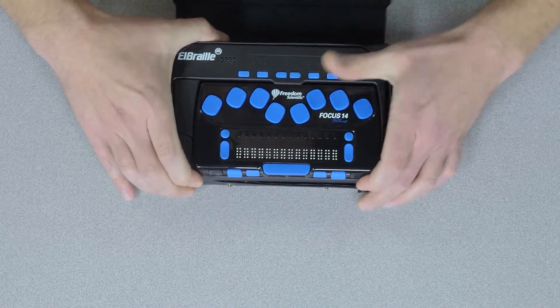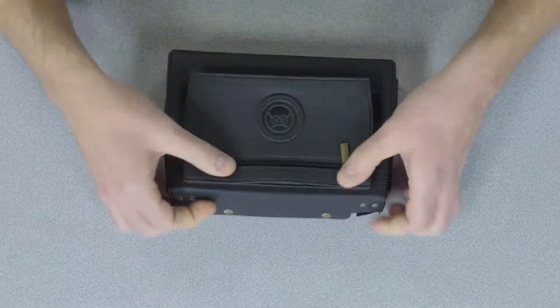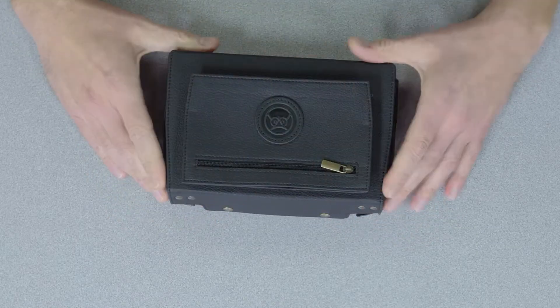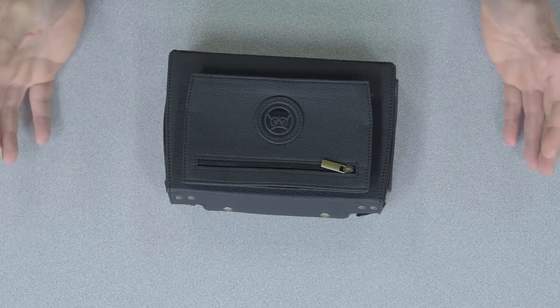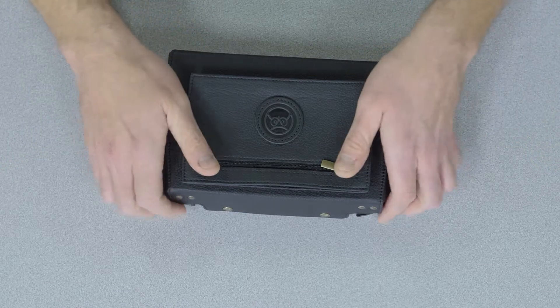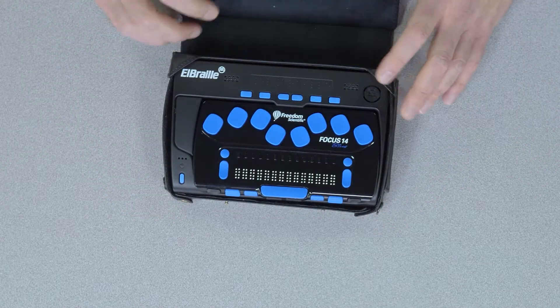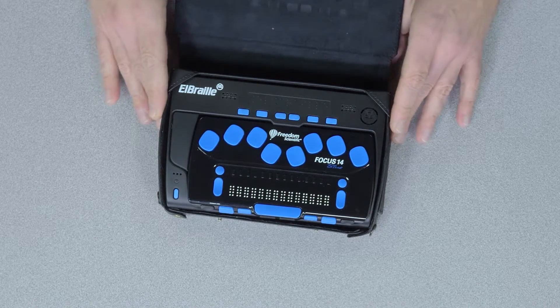It fits really nicely in this carrying case and snaps down just like that — you can carry any extra materials with you just like that. Essentially now a Braille user has a portable computer with them that they can use, access, and do all the applications that they would before. Like I mentioned, the battery life is incredible with these, so you get a long battery life.